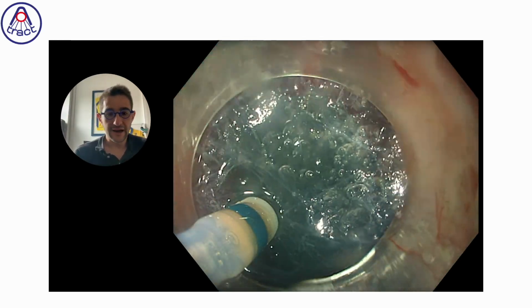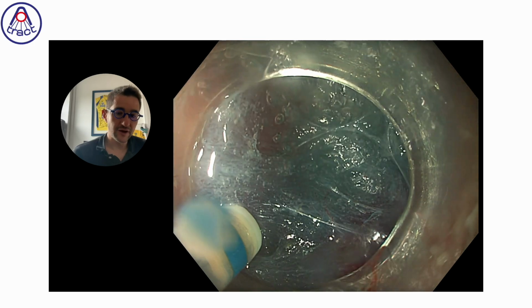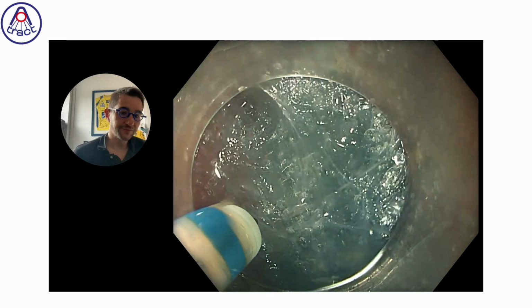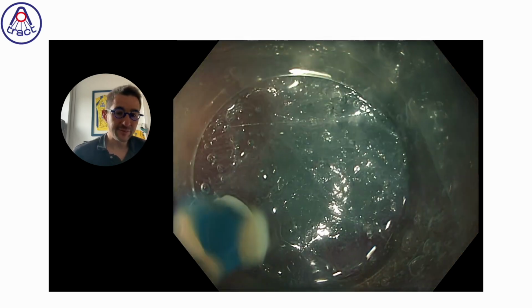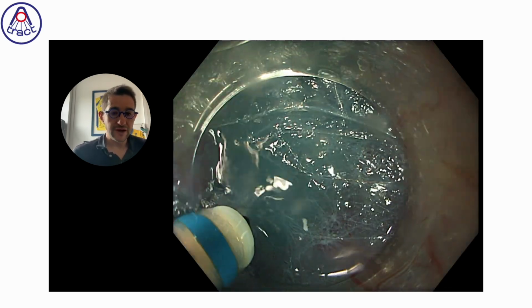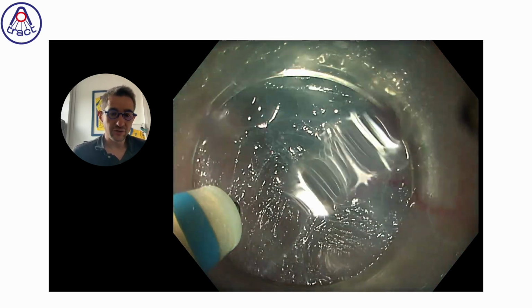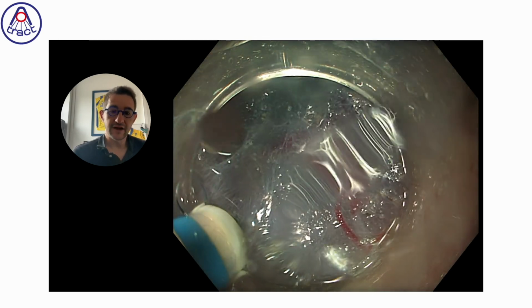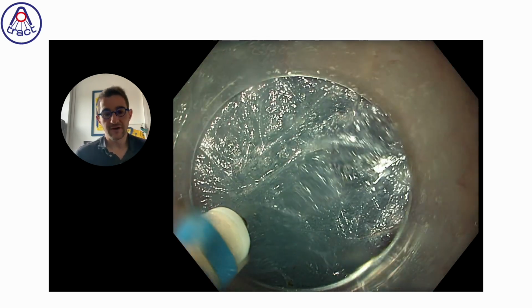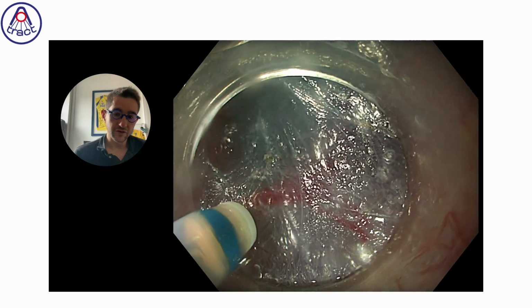And after, I like tunneling for this indication of small submucosal tumor because it is one of the best ways to stay close to the muscle and to have a relatively deep dissection, because I think it is really important to be as deep as possible for this kind of lesion, but also for malignant esophageal lesions, because you want to have the deepest margin you can get. And in this case, I wanted both to be close to the muscle without any damage.